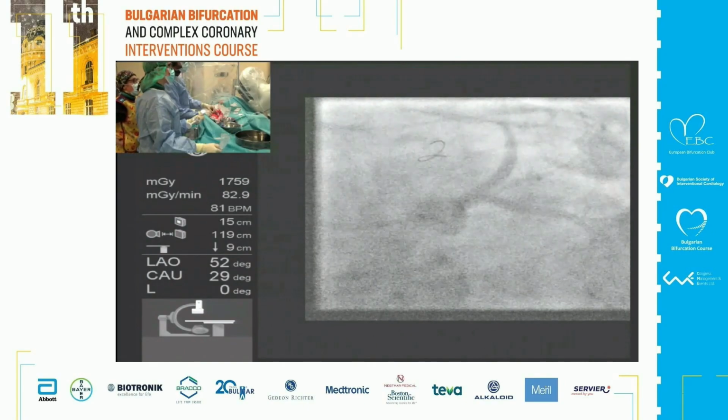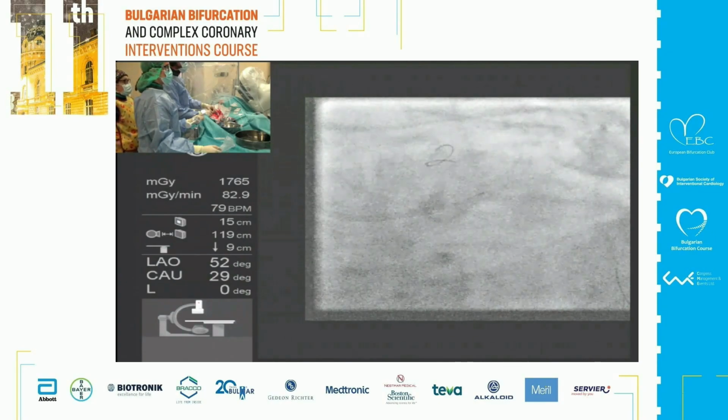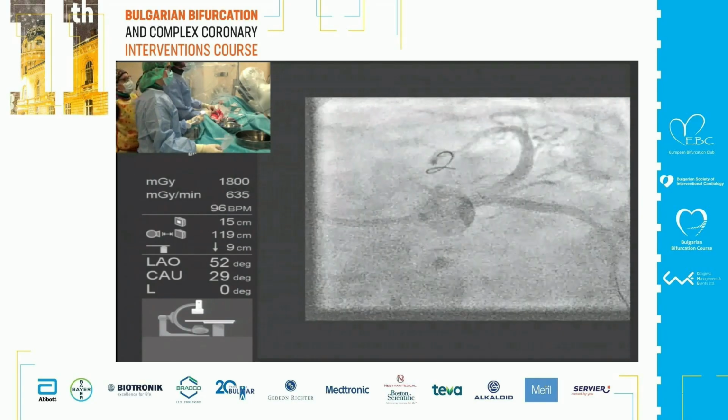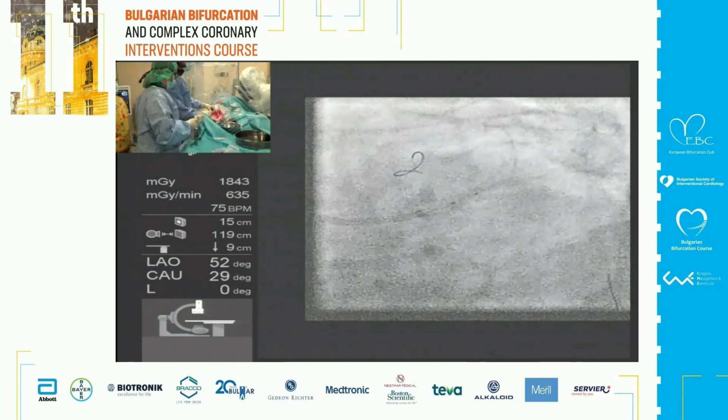Okay, show the position. So, small test. Okay, a bit more distal. A bit more. Maybe a little. Okay, test. Okay, that's good. I like the position. What do you think? 2, 4, 6, 8, 10. Good position. Go.